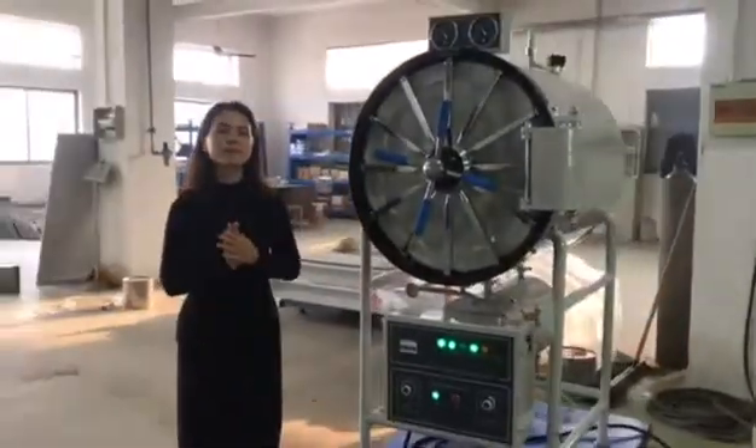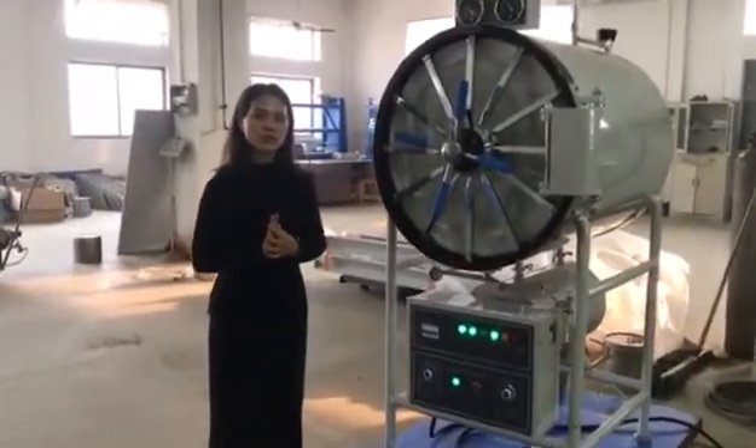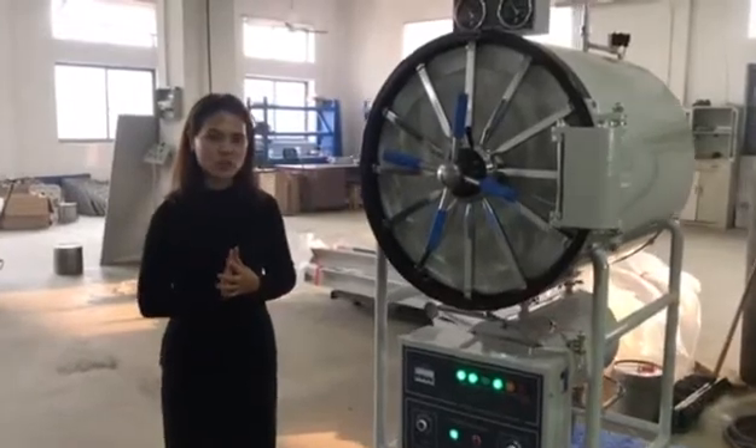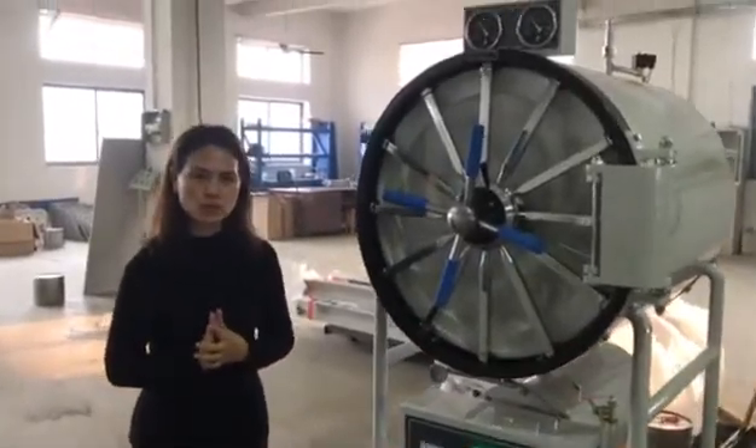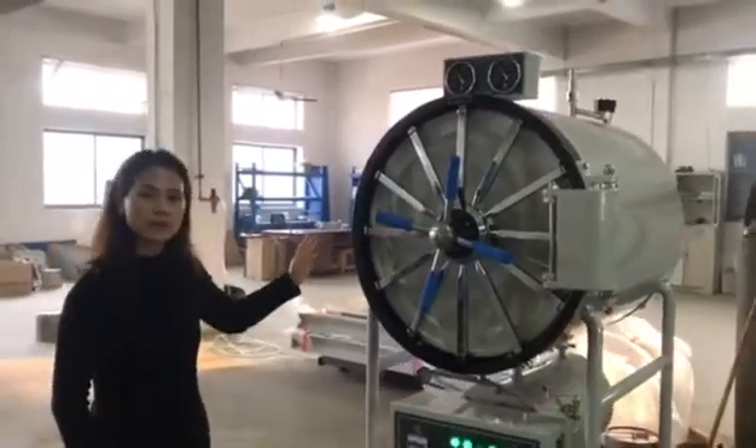The model has 5 types: 150 liter, 200 liter, 280 liter, 400 liter, and 500 liter. Now this one is 400 liter.